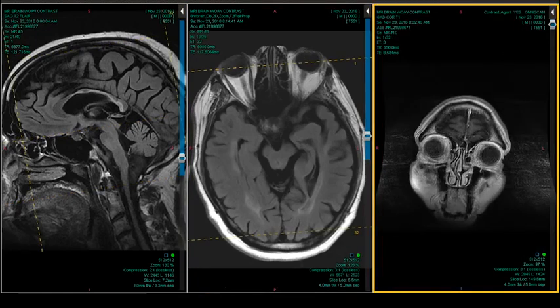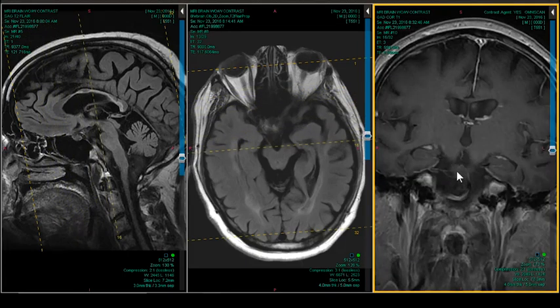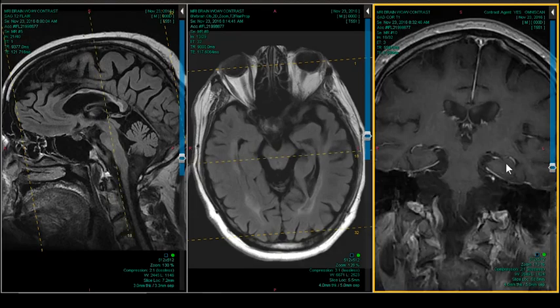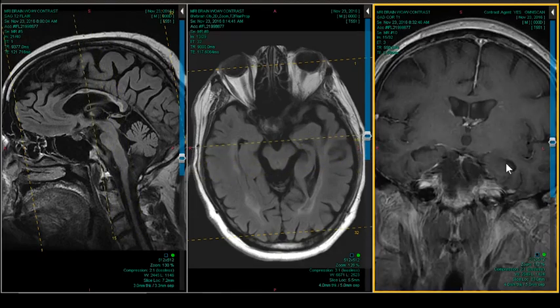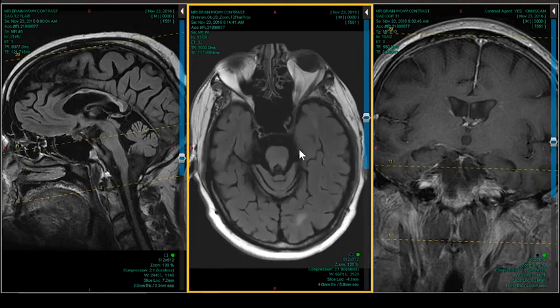I'm going to pull down the coronal, and I'm going to check out the entorhinal cortex because there's some serious atrophy here. So here's your choroidal fissure right here, and that one's pretty juicy, this entorhinal cortex. That one's not bad either. And I'm looking for things like choroidal fissure dilatation. How big are the temporal horns? The answer is they're a little dilated, but not nearly commensurate with the rest of the atrophy that's present in this case.